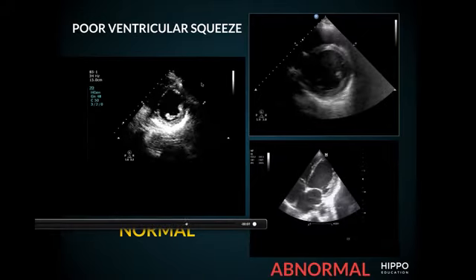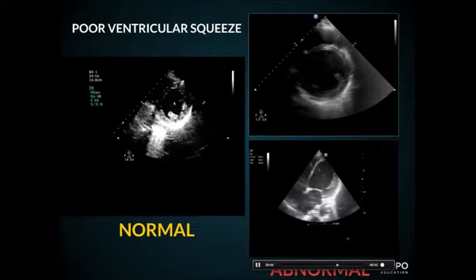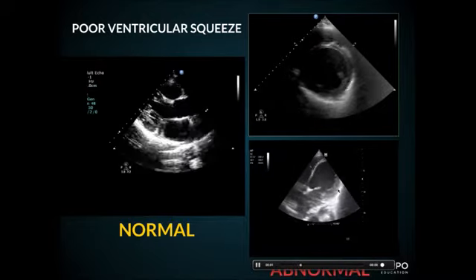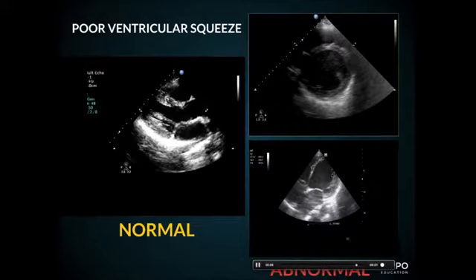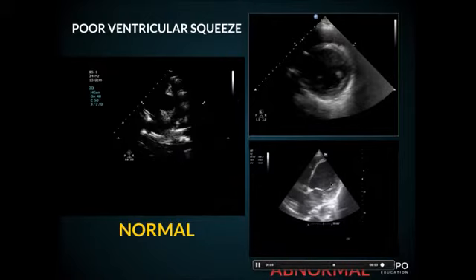Yep. This is compared to your, this is an apical 4-chamber, but you can see left ventricle, not a whole lot of pumpage going on there, right? It looks pretty weak. That valve is barely opening up. It's so backed up and not functioning very well. This person is going to be in cardiogenic shock or have really severe CHF, etc.